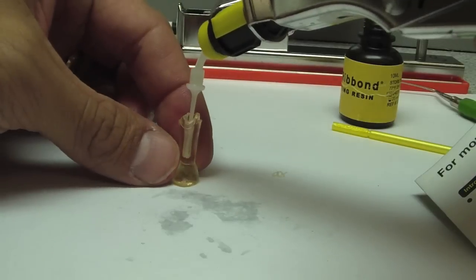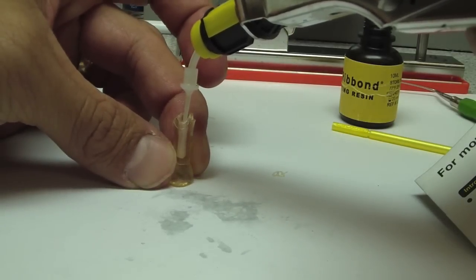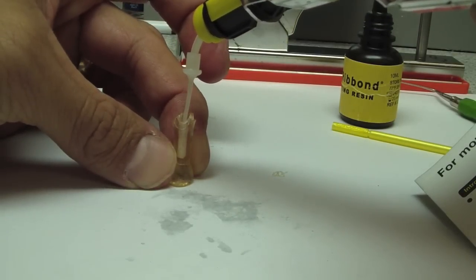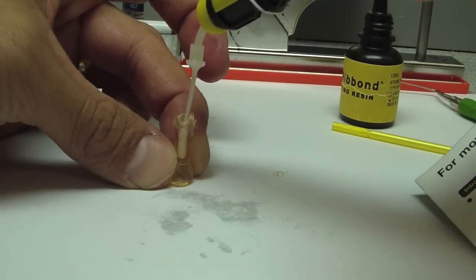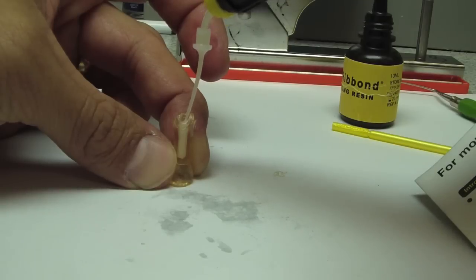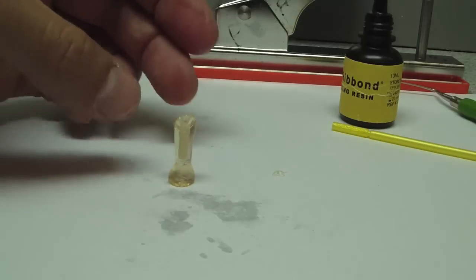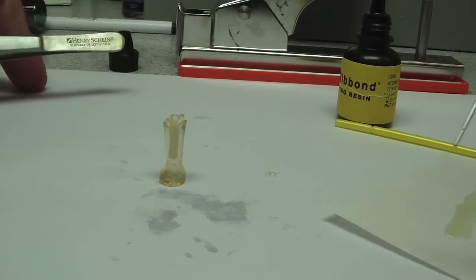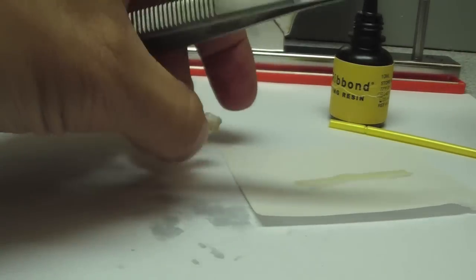Although I want to place my cement as apical as possible, the real key is during the condensation of the ribbon into the canal space. What I want to do is have a ribbon-dense, fiber-dense structure with as little resin in the canal as possible. That will prevent any shrinkage and increase the probability of having better adhesion to the canal space.